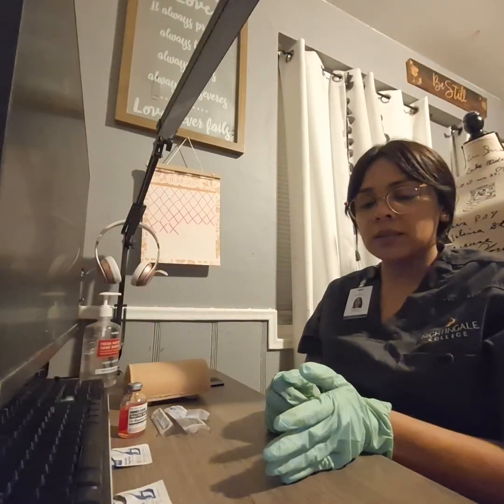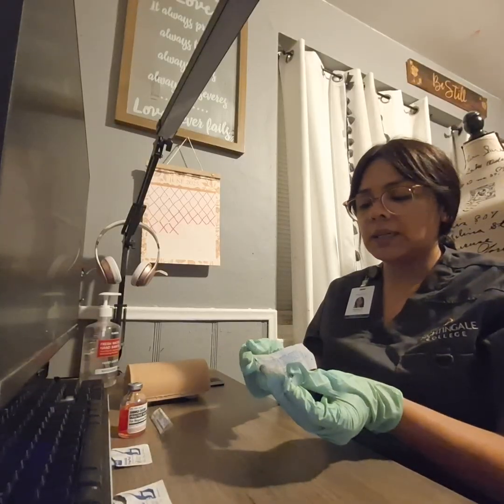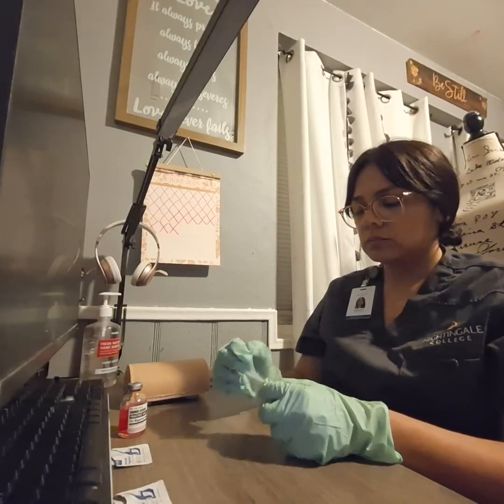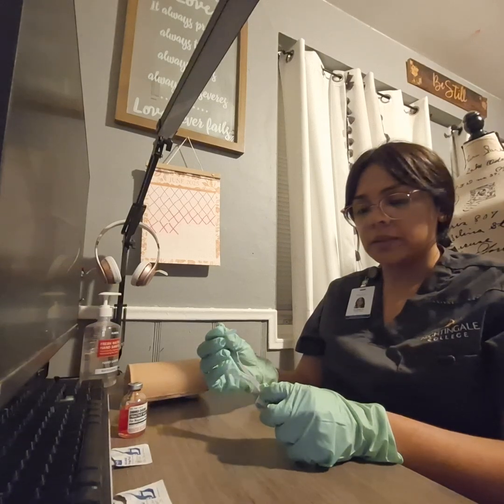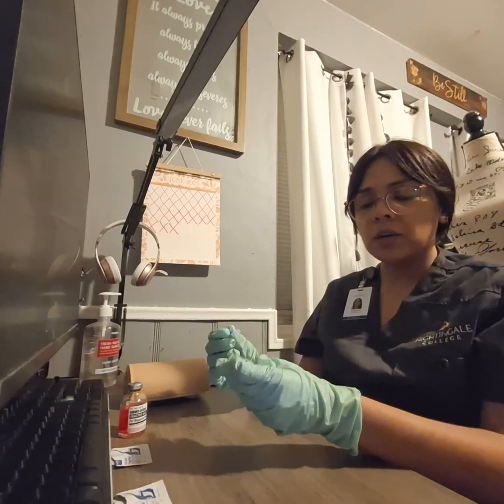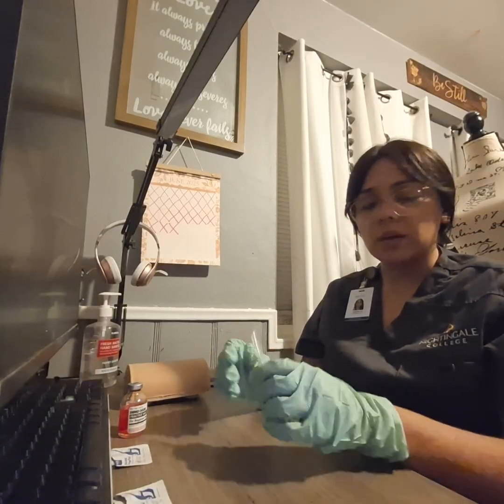Now I'll make sure I have the right syringe and the right needle. For the syringe, we will need a 3 ml syringe. And for the needle, we'll take a 25 gauge needle. This is specifically a 1 inch needle. So depending on the patient's weight and body mass, we may consider a 5/8 inch needle. Again, it depends on the patient's weight and body mass.